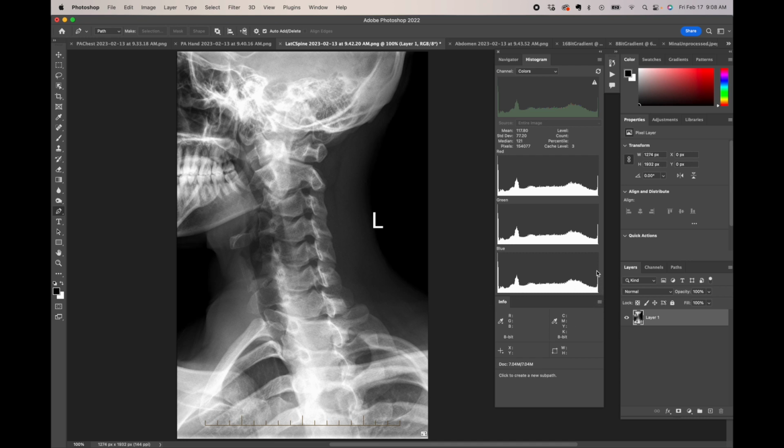You notice this little spike of white right here on the far right. That's probably representing something in here, like up here, this tooth actually reads as 248. The value of 248. If I come over here to the side of the neck, that is at 2.